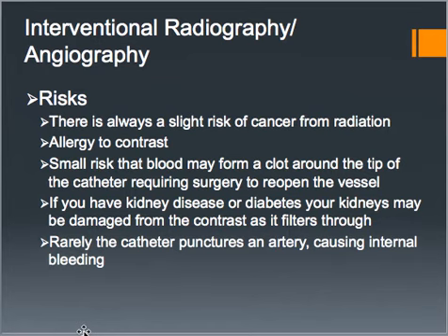Risks. Like I said before, even though I said there's no risk, we list it as a risk because anytime we're giving radiation to a patient, there's a slight risk of cancer developing later. There's a risk of an allergy to contrast. If you have a history of an allergy, then the radiologist may advise you to take a special medication for 24 hours before the exam to premedicate and stop that allergic reaction from happening. If a large amount of contrast material leaks out into the skin where the IV is placed, then skin damage can result.